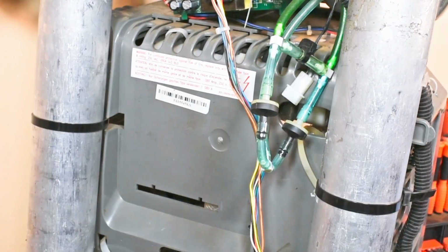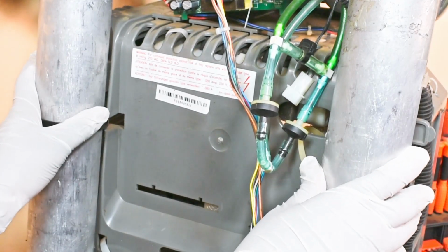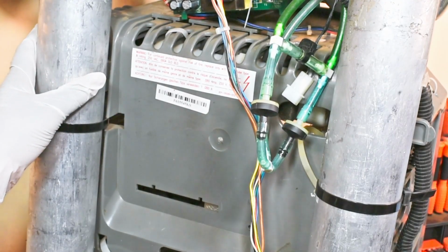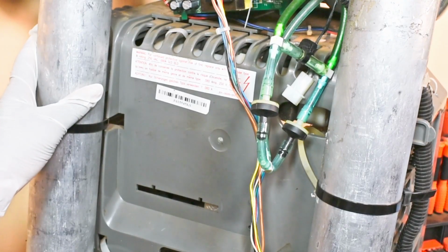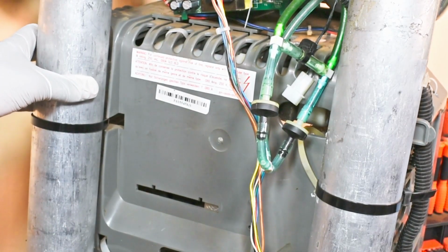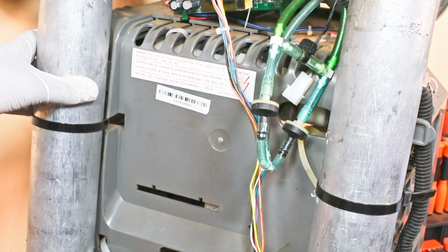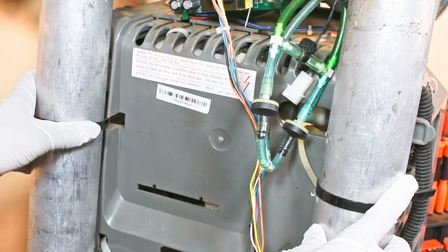Another cause of low oxygen purity is degraded zeolite. Oxygen concentrators have two sieve beds, as you can see, and these are filled with a material called zeolite. Zeolite separates nitrogen from compressed air, thereby concentrating oxygen. Over time, zeolite degrades, and this can be accelerated by factors such as exposure to moisture. This reduces its efficiency in absorbing nitrogen. As a result, more nitrogen remains in the air passing through the sieve beds, leading to decreased oxygen purity.